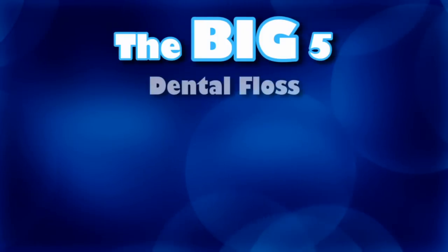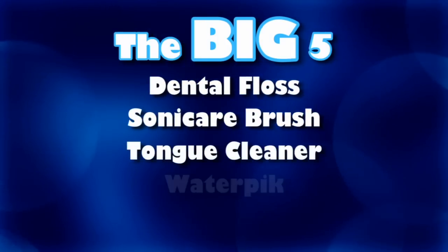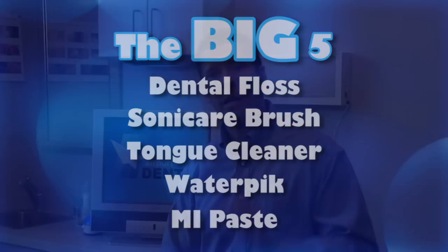Anybody can keep their teeth for a lifetime. It starts with what I call the big five: dental floss, the Sonicare toothbrush, the tongue cleaner, the Waterpik, and the MI Paste. I'd like to talk to you a little bit more about each one.